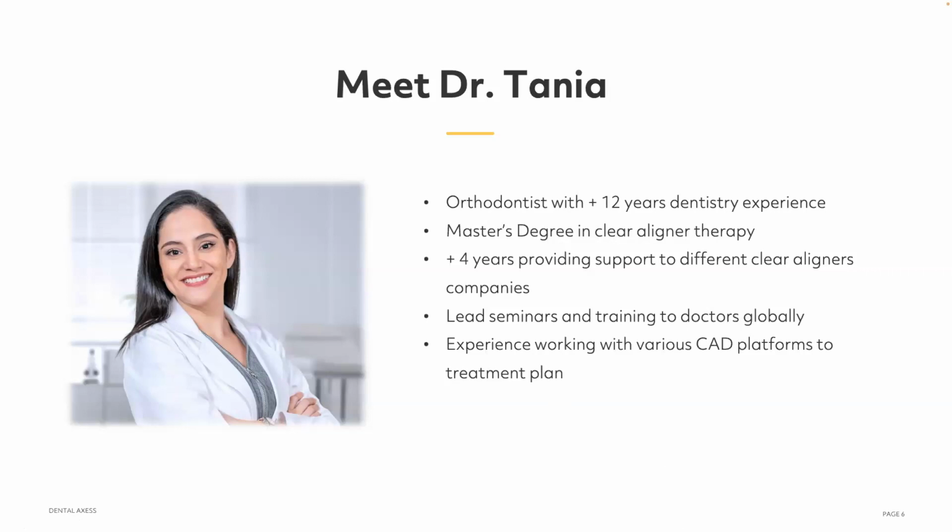All these companies bring different types of protocols or ways to work, and working with orthodontists around the world has brought me a lot of new information on how clear aligners work and the best way to provide great outcomes to our patients.